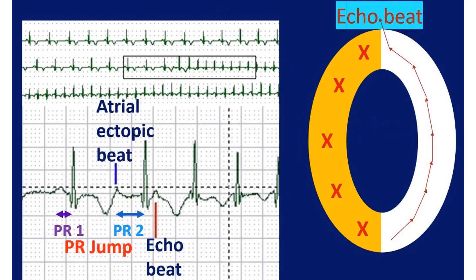When the atrial ectopic beat gets conducted down the slow pathway, there is a sudden increase in PR interval compared to the previous sinus beat. This is known as a PR jump, and it has to be more than 50 ms to be significant. The monitor tracing shown here illustrates the PR jump for the ectopic beat and an echo beat just after the QRS.